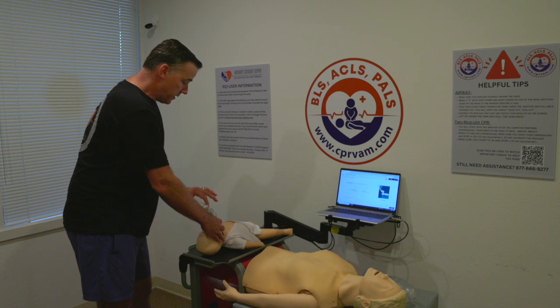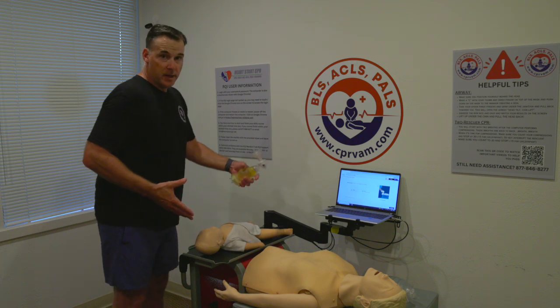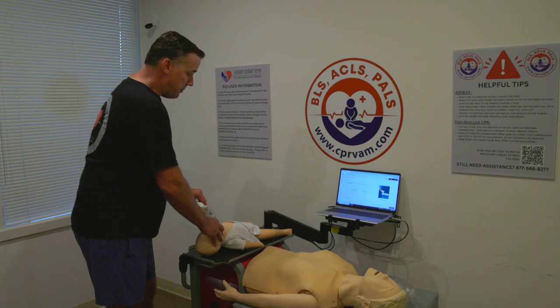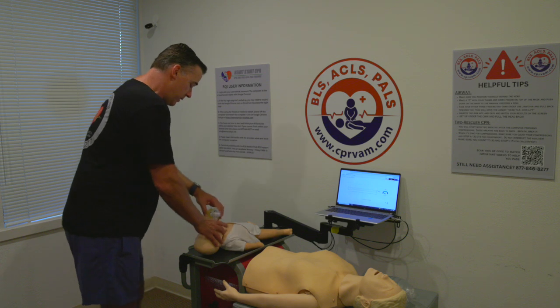If you look at the bag-valve mask, this is a lot of air — the infant's lungs are super small. An infant is considered newborn up to one year old, so there's a variety of sizes. We want to squeeze the bag just enough to see the chest rise or see our results on the screen. We're going to give one breath every three seconds.